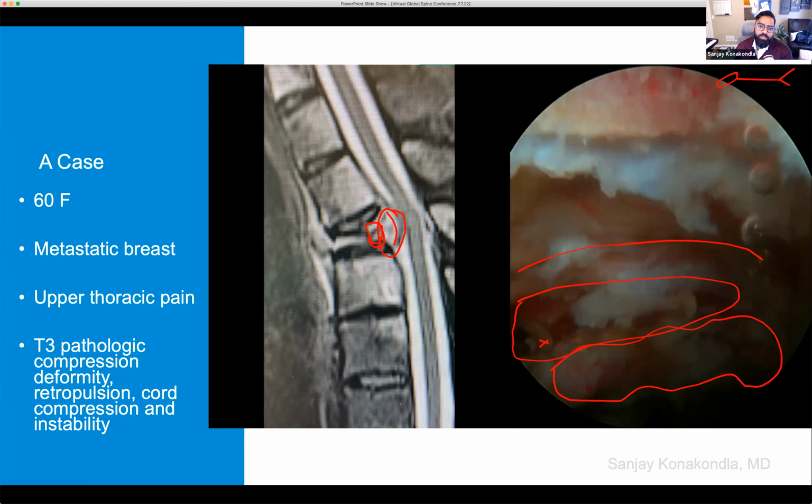And that saves me sneaking around the cord and really passing along Woodsons and things from the back, which is simple enough to do, but I like to get a lot of the anterior work done through the scope.